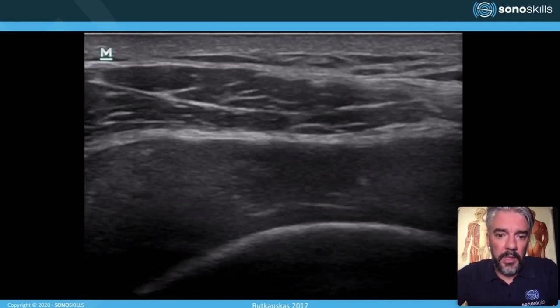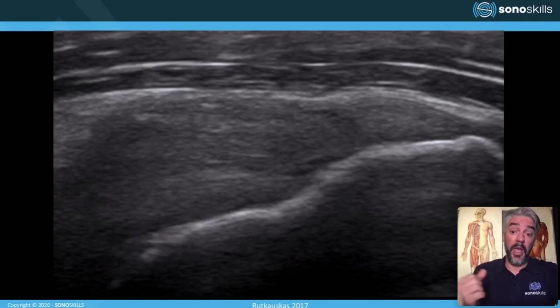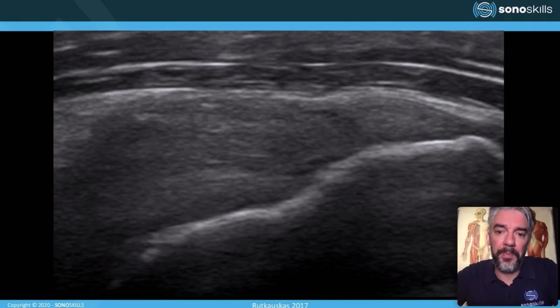Sometimes they can be very subtle. So in this case, there is also a tear. You can also see that the top of the bursa is not really convex, but there is a small concavity there. So also in the depth, you can see this change in echogenicity, and this is a fully torn supraspinatus. And when producing a stress against abduction, you might see that it opens up.